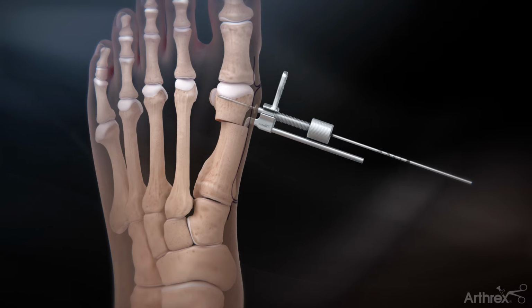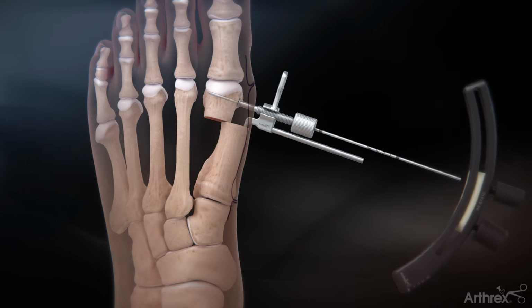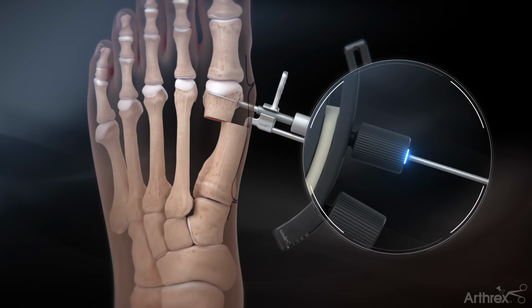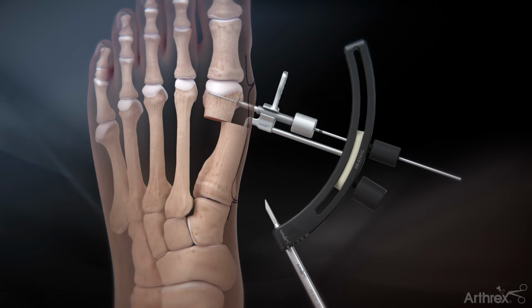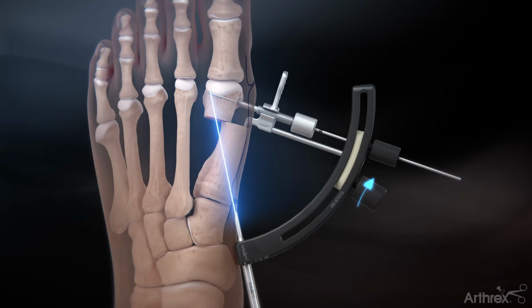Turn the knob on the shifting device clockwise to shift the capital fragment laterally. Slide the guide over the capital fragment guide wire and tighten knob 1 such that the top of the knob is flush with the thickest laser line. With the first K-wire sleeve in the most proximal slot, slide the guide proximally and tighten knob 2 based on the desired entry point for the proximal K-wire.